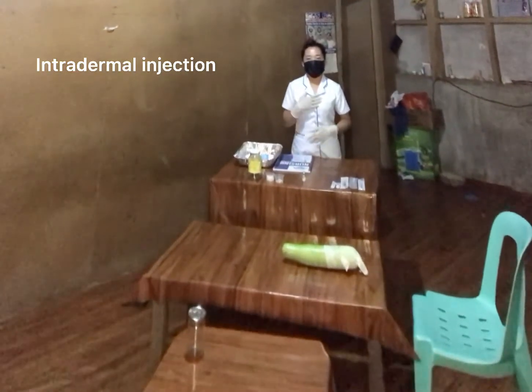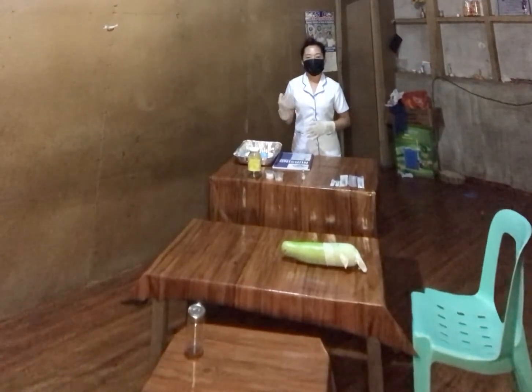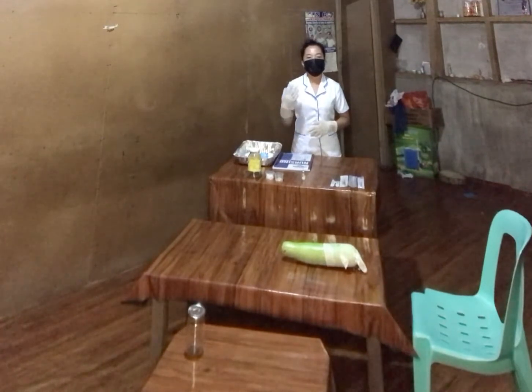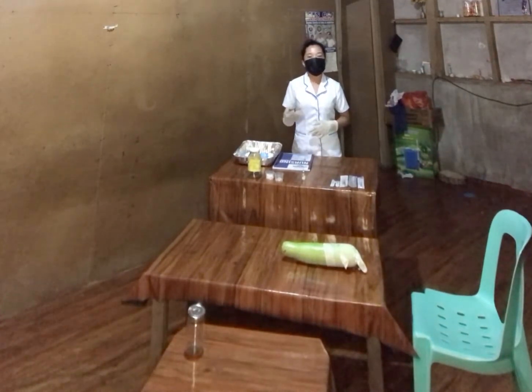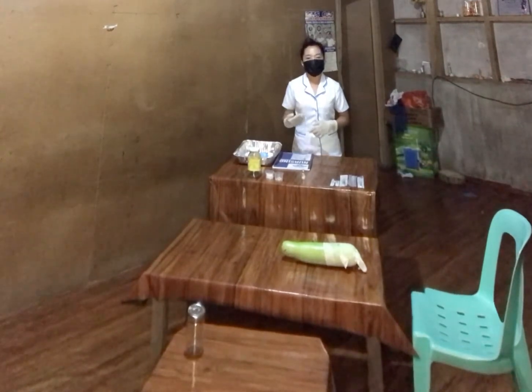Everyone, my name is Ellean from ENAD, BSN1A, and for today I'm going to demonstrate how to conduct parenteral administration. Under the parenteral administration, we're going to perform intradermal injection and intramuscular injection.